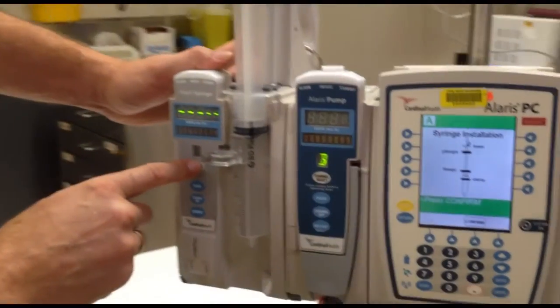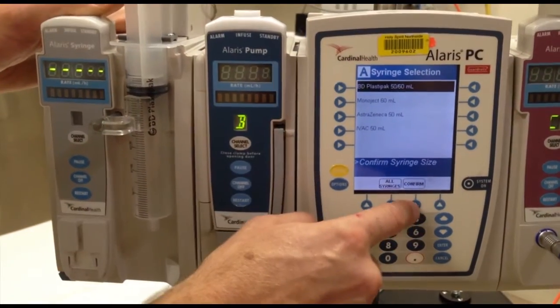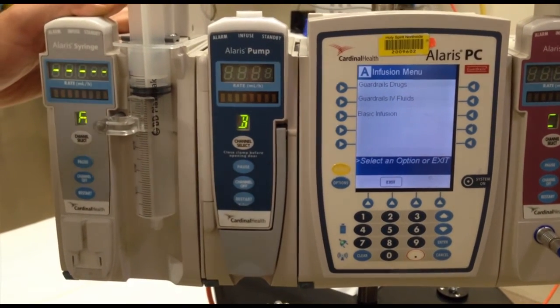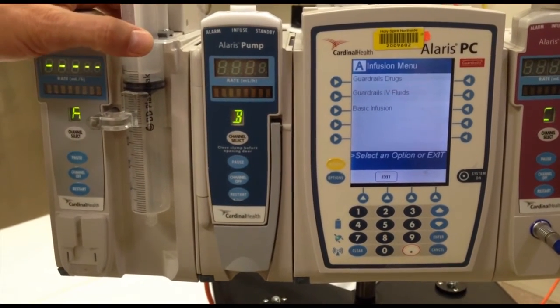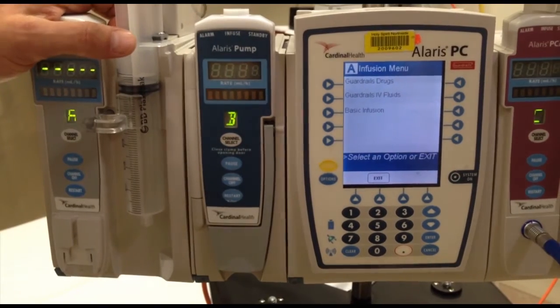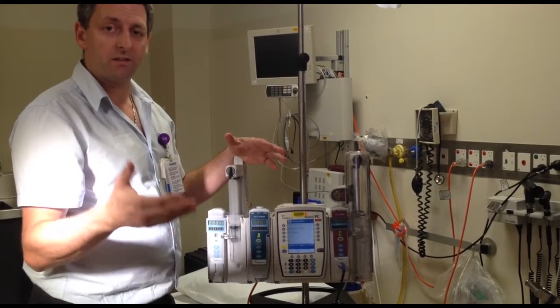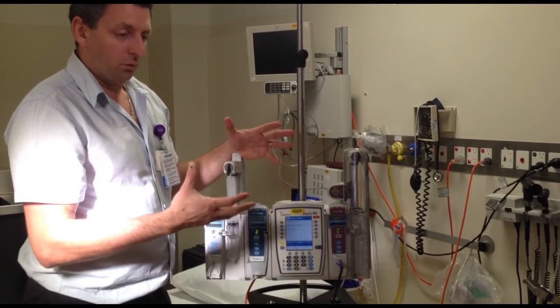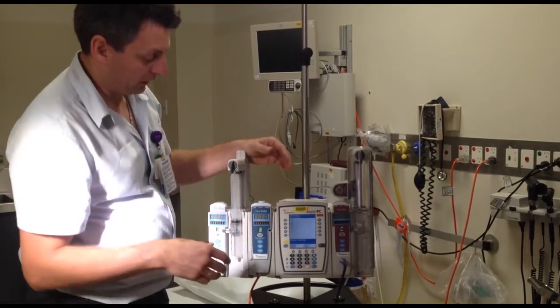Then I'll press channel select and it will ask what's the syringe selection — I'll say BD plastic because that's what we're using, press confirm. Then it gives me three options: guardrails drugs, guardrails IV fluids, or basic infusion. The hospital has made a data set that has most of the medications we use — it's all under guardrails, which is a safety medication system. If you use medication in basic mode, you are taking responsibility yourself and you're not working inside hospital policy. So if you do have a drug error, it'll be on your own head, not the hospital's responsibility.